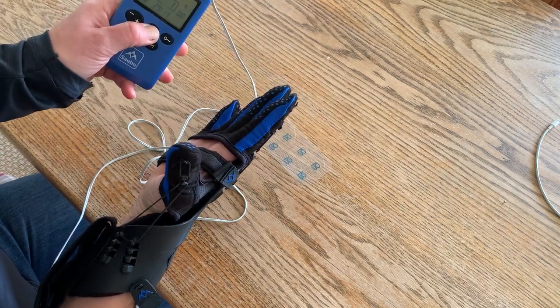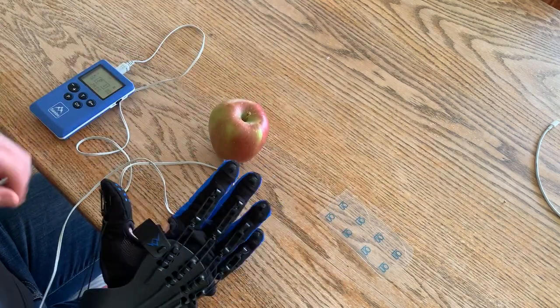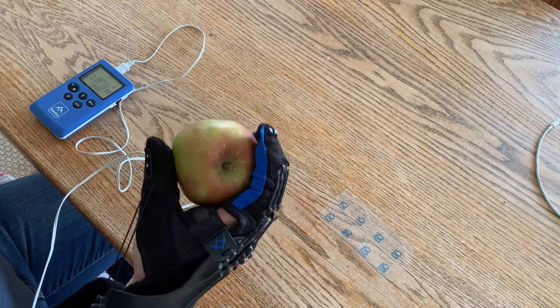From the side: press T and the stimulation comes on; when I stop pressing it goes off. So if I want to practice a task such as picking up this apple, I wouldn't use any stimulation to go forward — this is my own squeeze.